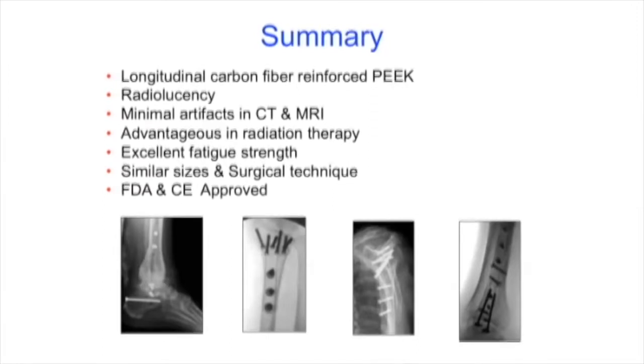She went to an orthopedic surgeon in Illinois where her hometown was, and they'd never heard of this implant before. So they called me, and I immediately called Carbofix, and Carbofix said, no problem, we'll send someone up there. I think they got in touch with Kevin, got it set up there, and they were able to get the nail out, no problem.